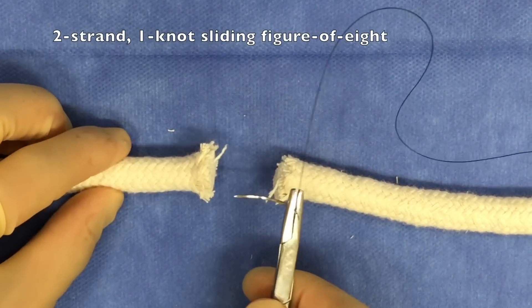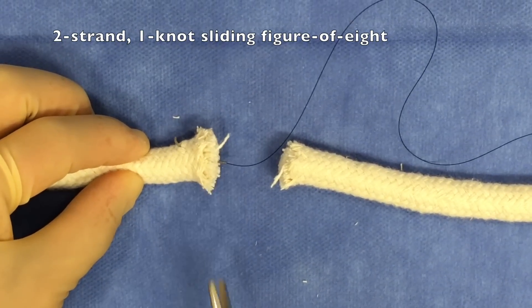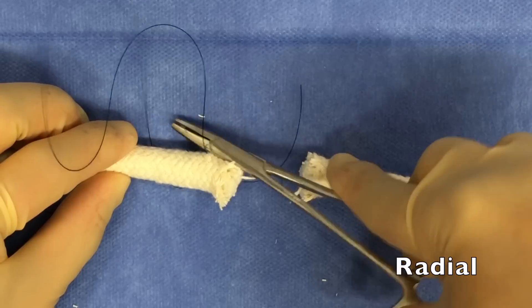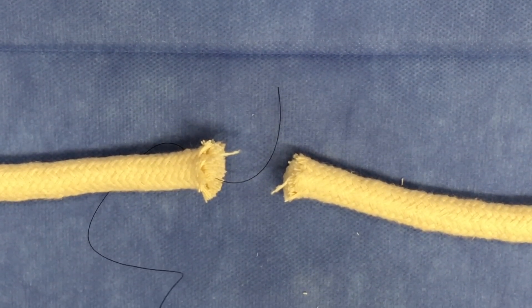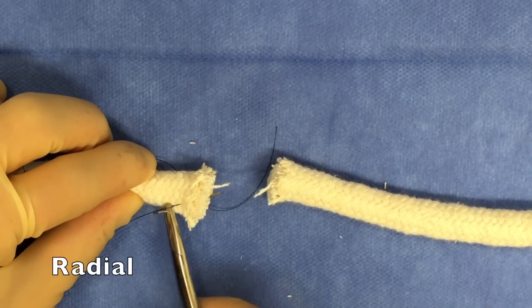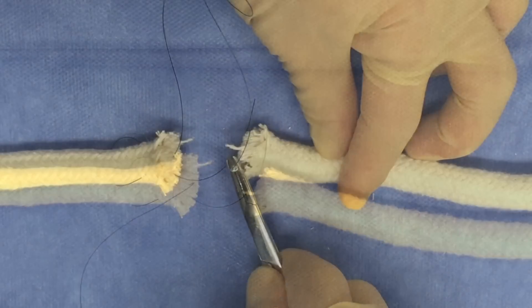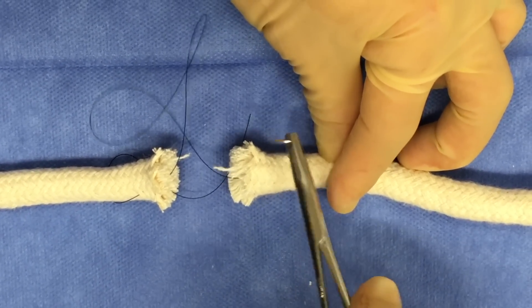To complete this video, let me show you one other variation on this technique, which is commonly reported — and this is a two-strand, one-knot sliding figure of eight pattern. So really similar, but instead of a mattress pattern, you're going to use the figure of eight pattern, which is familiar to most emergency medicine providers. Let's say you begin on the radial side of the tendon. You're now going to pass from the cut edge into the tendon itself, exiting more on the ulnar side of the tendon. You'll then pass the suture behind the tendon — or as shown in the previous variation, suture through the ventral aspect of the tendon itself — and this time you're going to enter on the dorsal part of the tendon more to the radial side.